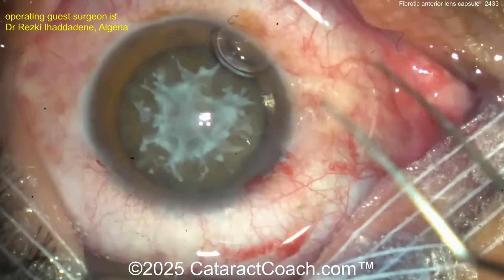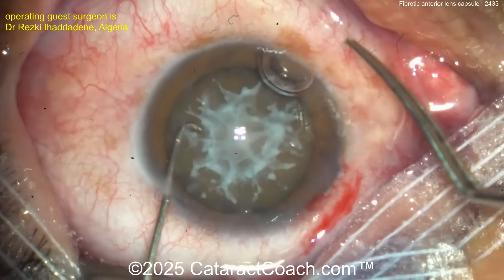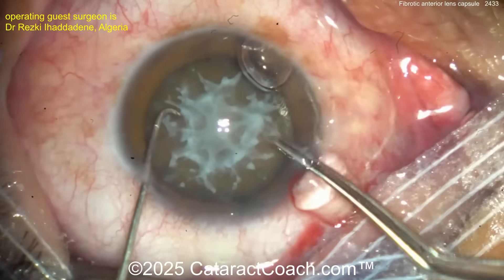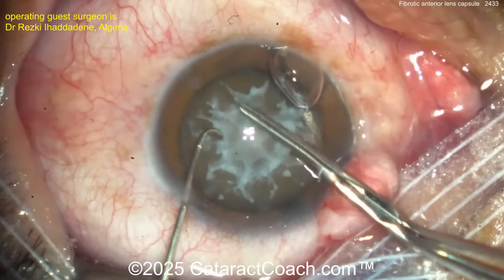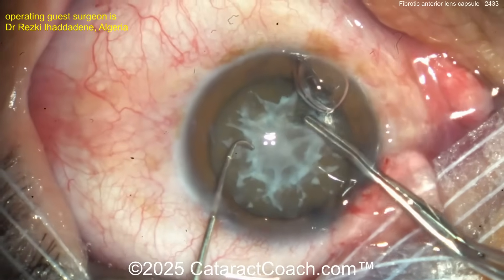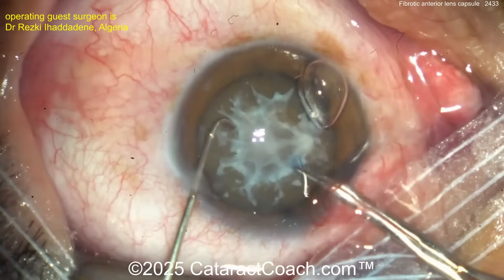It looks like topical anesthesia. In a case like this I'd be tempted to do Tenon's or peribulbar or something else. Fixating now — left hand, right hand going in with the capsule forceps. Getting that rhexis — look at that, it's almost getting stuck.